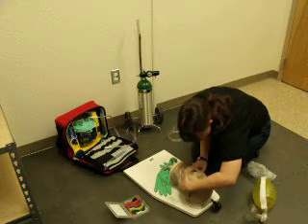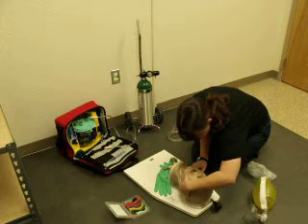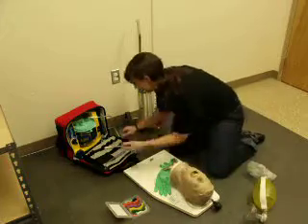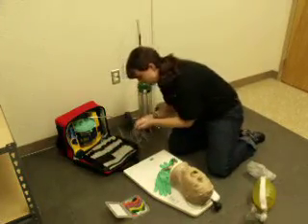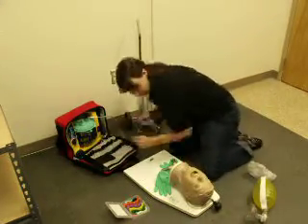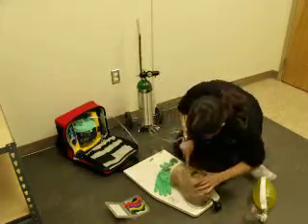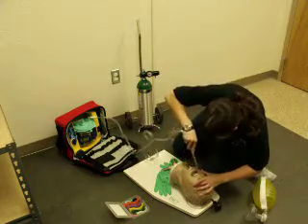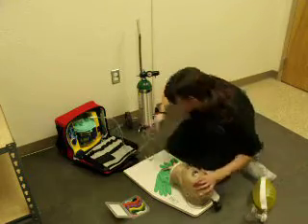You've palpated a weak carotid pulse at a rate of 60. The mouth is full of secretions and vomit. I'm going to call for backup and I'm going to suction — making sure that I cover the vent. Airway is clear.